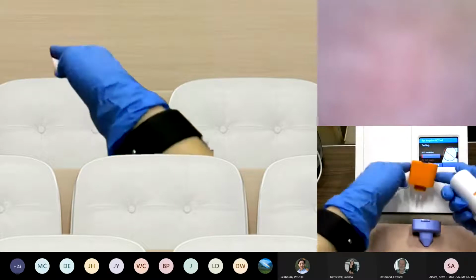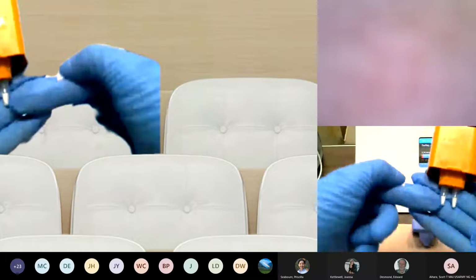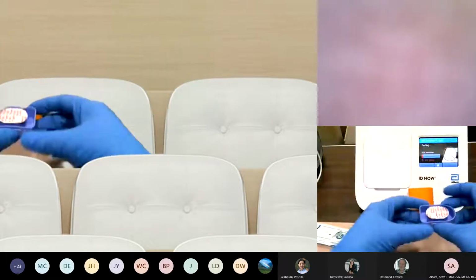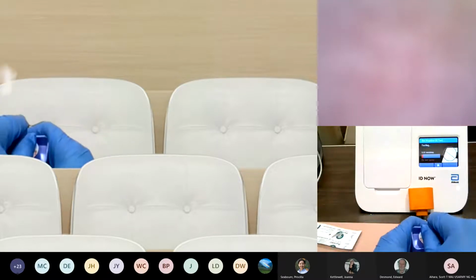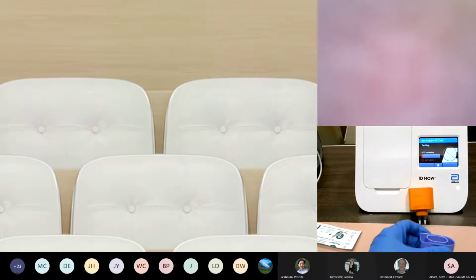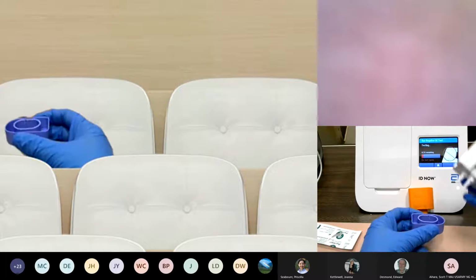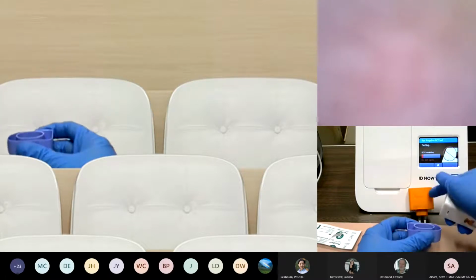Here's the usual setup. We've got the test space, there's freeze-dried reagents down below. We've got our blue sample receiver. After a warm-up, we remove the seal, mix the swab. People usually do that portion correctly. And step 5 is when we move whatever's in here into here.